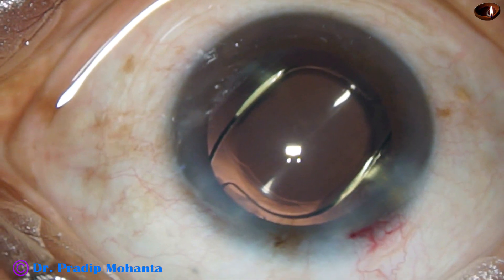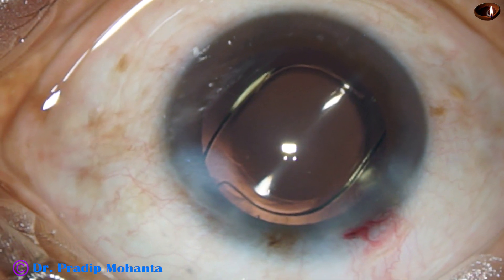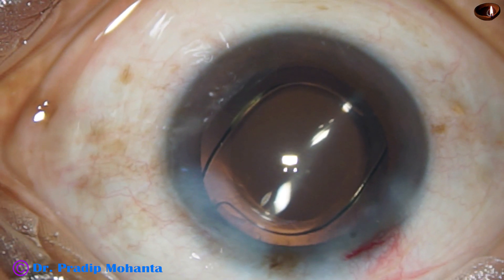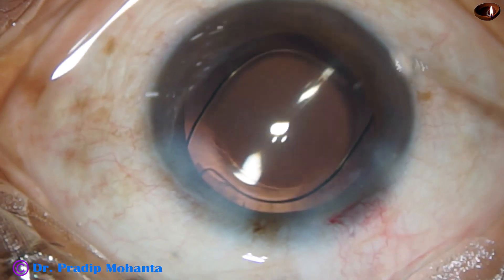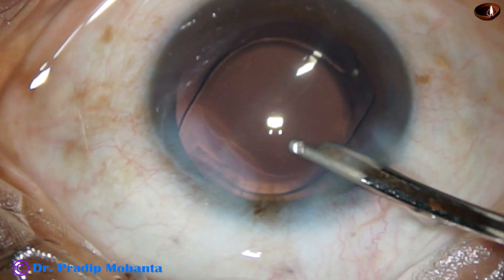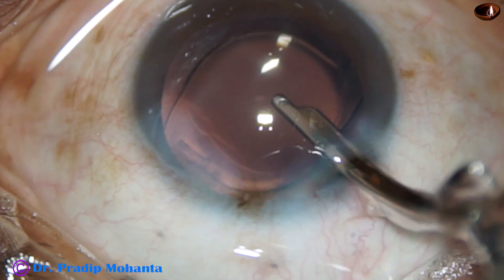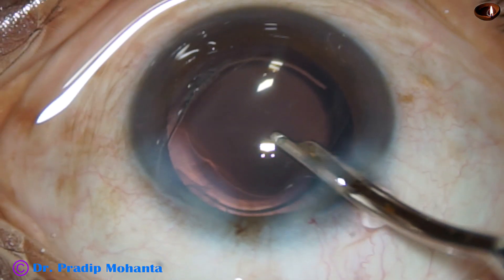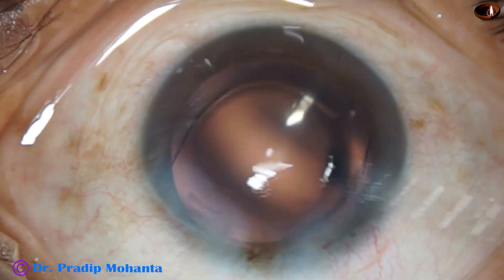This is moxifloxacin. Now the side port is closed by hydrating the corneal stroma on either side of this stab wound. And now we are done. This is the final lavage of the anterior chamber. The visco that sticks to the corneal endothelium is nicely removed. The anterior chamber is nicely formed and the case is concluded.